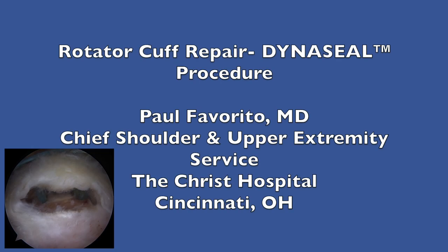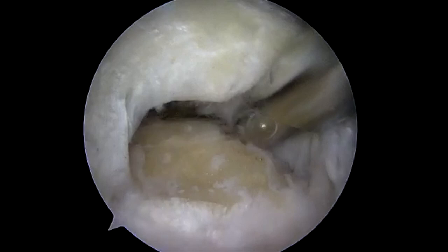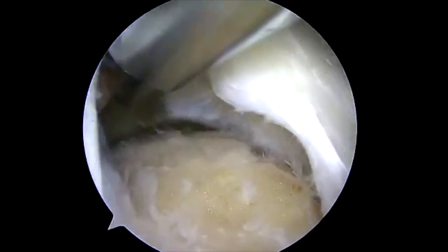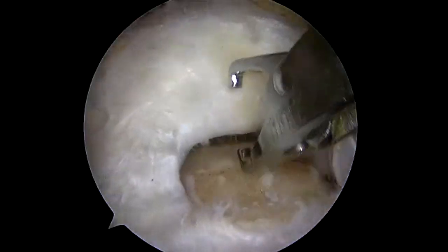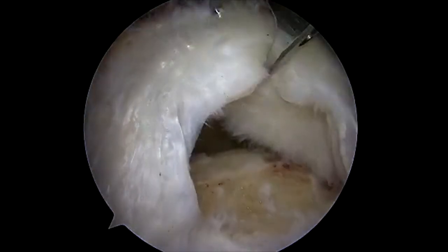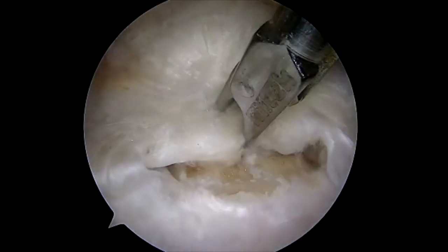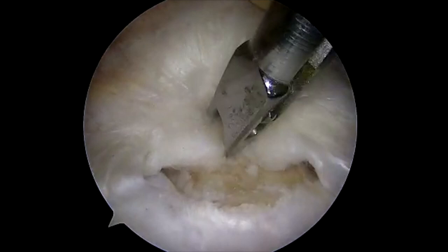This video will demonstrate a rotator cuff repair using the DynaSeal procedure. This patient has a full thickness supraspinatus tendon tear. The patient is positioned in the beach chair position. Viewing is performed from a lateral portal, and through an accessory anterolateral portal, the rotator cuff tear is inspected after the greater tuberosity has been prepared to a bleeding bony surface.